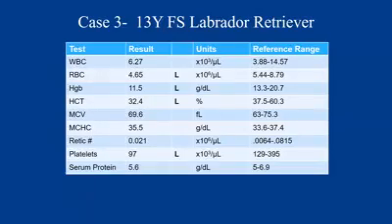This is some data from the analyzer. Our white cell count was within reference interval. The patient had a very mild normocytic, normochromic, non-regenerative anemia, so again, probably anemia of inflammation in this patient. And we had a moderate thrombocytopenia. I can tell you there was no platelet clumping on this patient's blood film, so the thrombocytopenia is real.